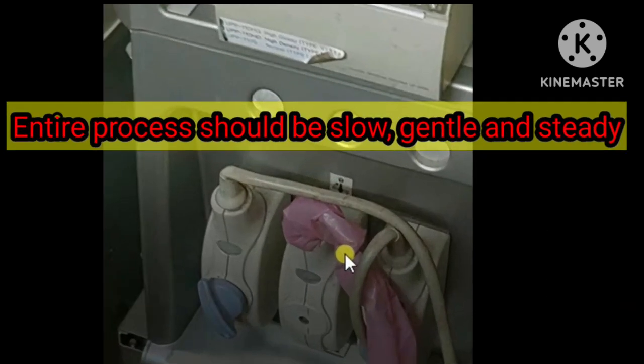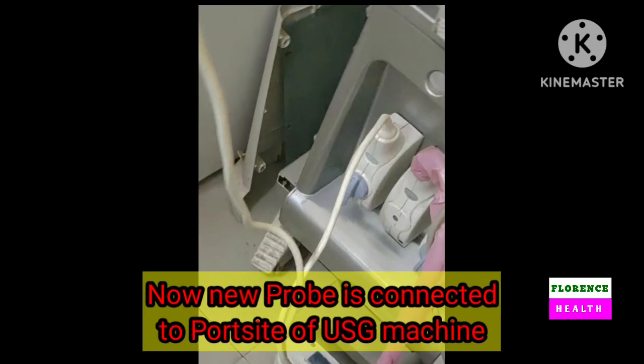Entire process should be slow, gentle and steady. Otherwise you will be in problem always. Now the new probe is connected to the port site of the ultrasound machine. See the slide how it is connected.